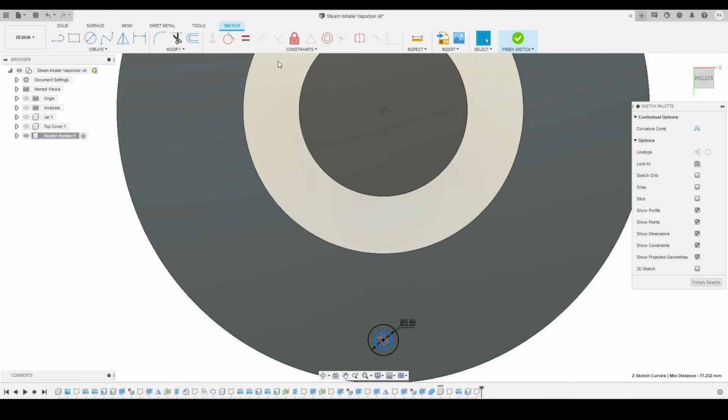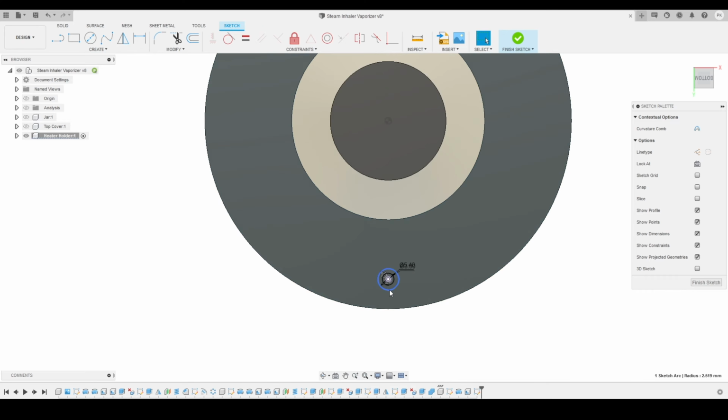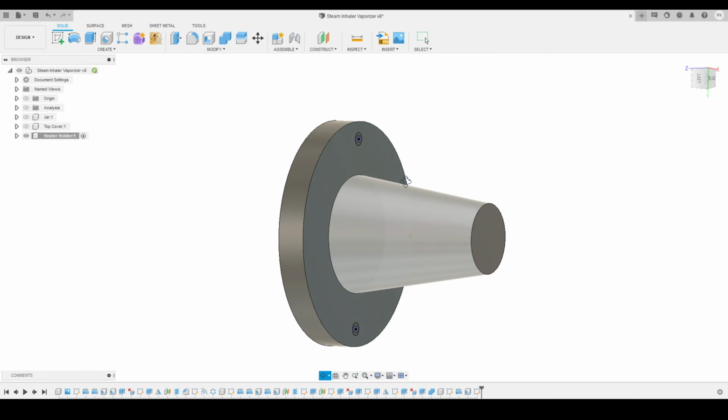Again we'll select the outer circles and apply the equal constraint. And here you can see now I can click on finish sketch. Okay, so I think we had missed something. So I just go back to our sketch again by double clicking.